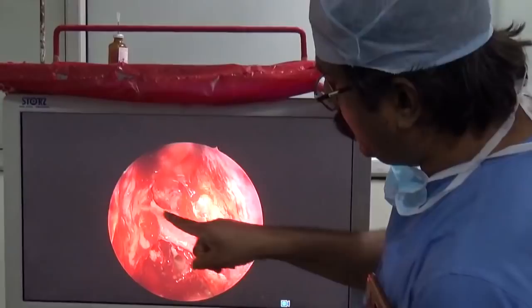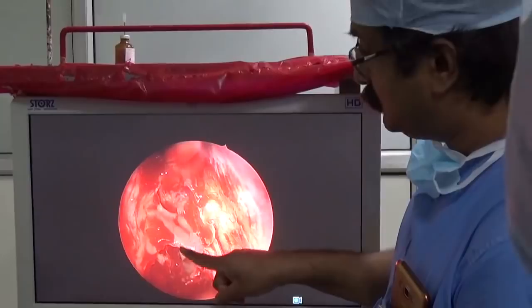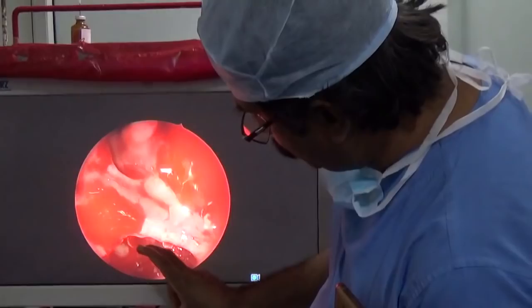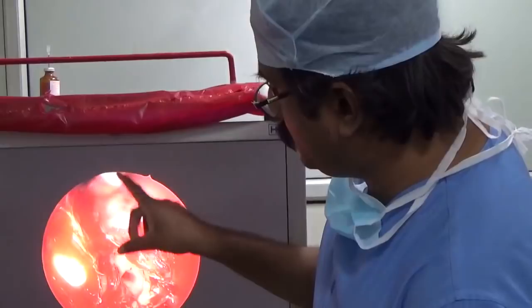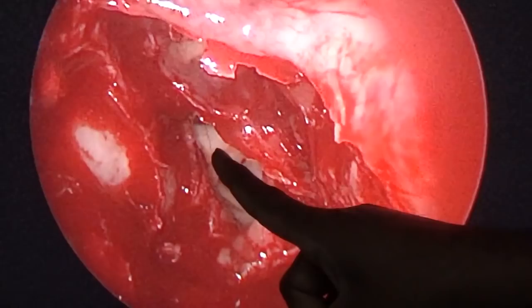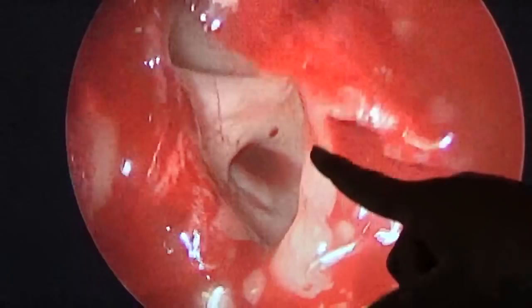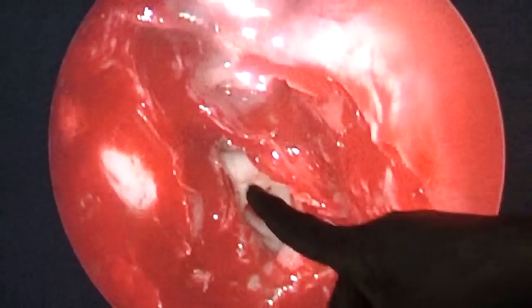This is the vertical part of the basal lamella. Entering is always just at the vertical part of the basal lamella. The minute you cross the basal lamella, that means you are entering into the posterior parts. Always look laterally. At any point, you should not injure the optic nerve — that is our goal. Once you cross the basal lamella, look laterally. This is cone-shaped, and it is the optic nerve. The recess above is called the supra-optic recess; the recess below is called the infra-optic recess. These two lead to the anterior clinoid in the posterior parts.